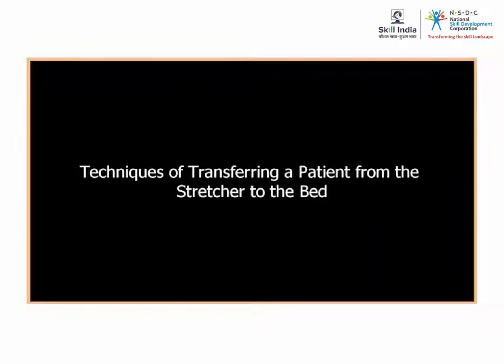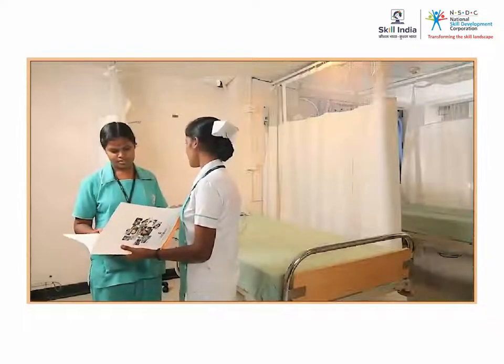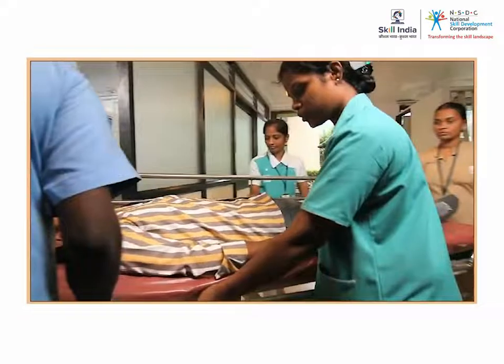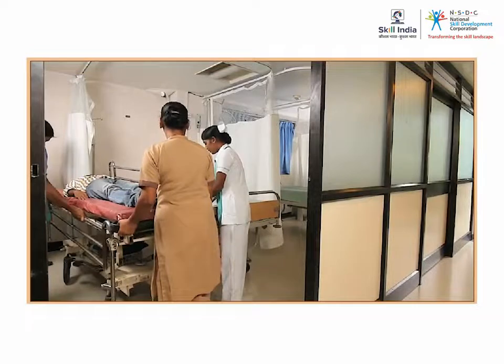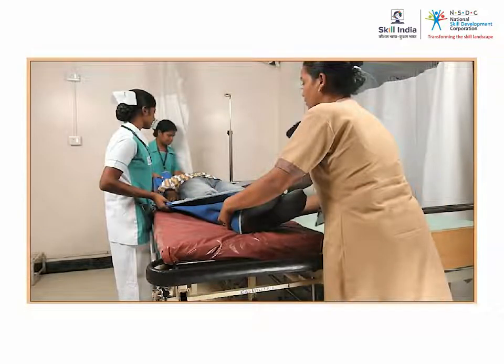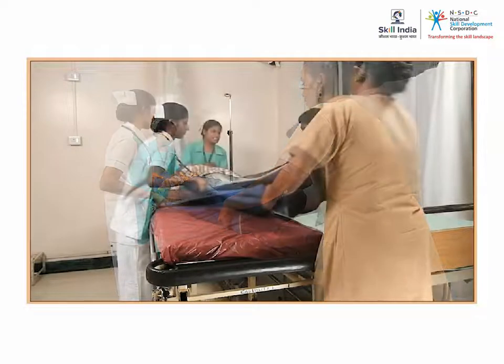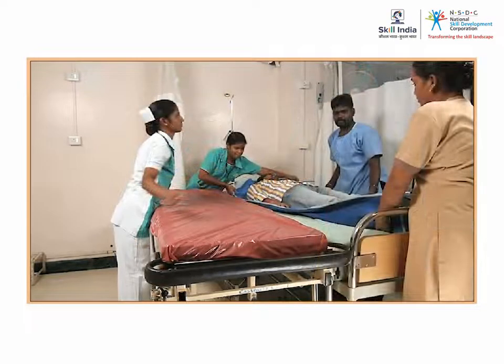Techniques of transferring a patient from the stretcher to the bed. Before transferring a patient from the stretcher to the bed, report to the nurse about the transfer of the patient into the ward. Once the patient is brought into the ward, the following techniques need to be followed. Ensure that there are at least 2 other hospital assistants to help you when the patient is transferred to the bed.